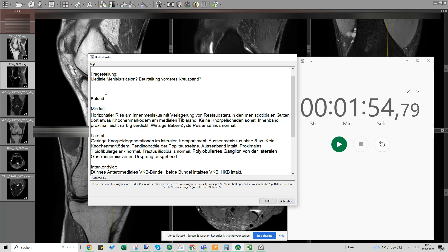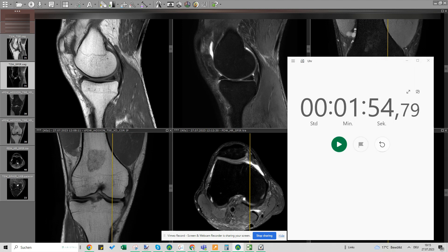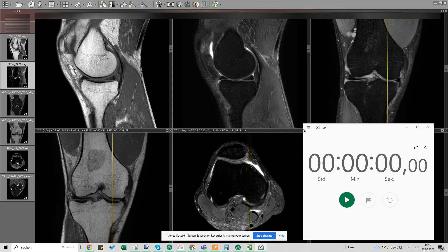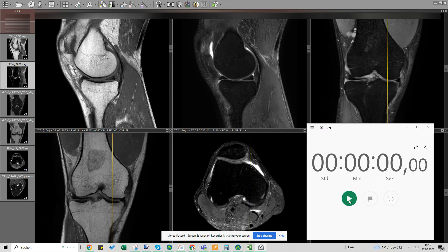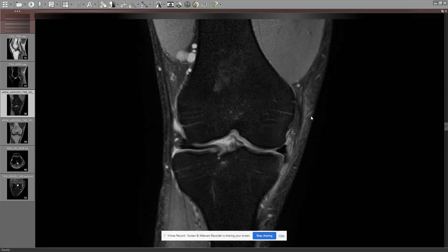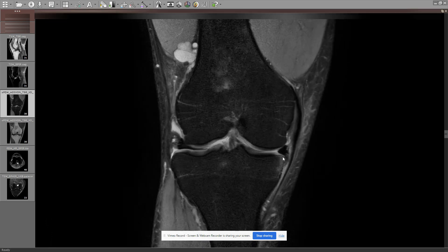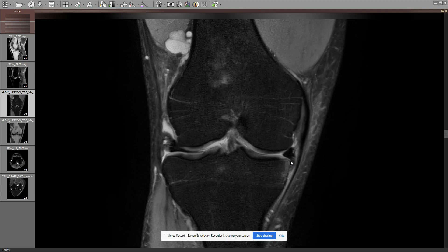So this would be the report. Let's go through this again at maybe the normal speed that I would do. I'm not dictating, I'm just going through the case now. So I would look at the meniscus and we can see already here the main finding.